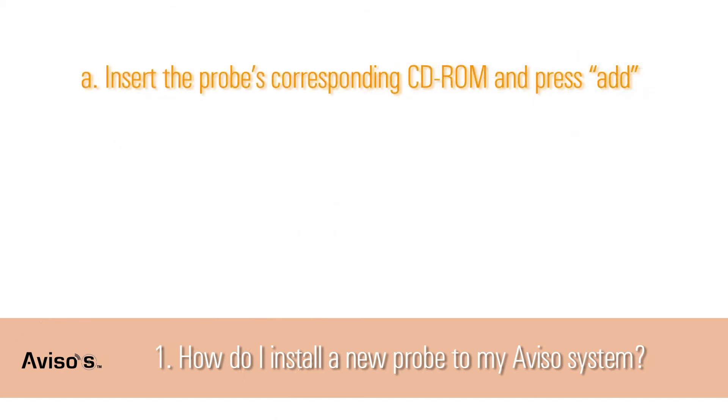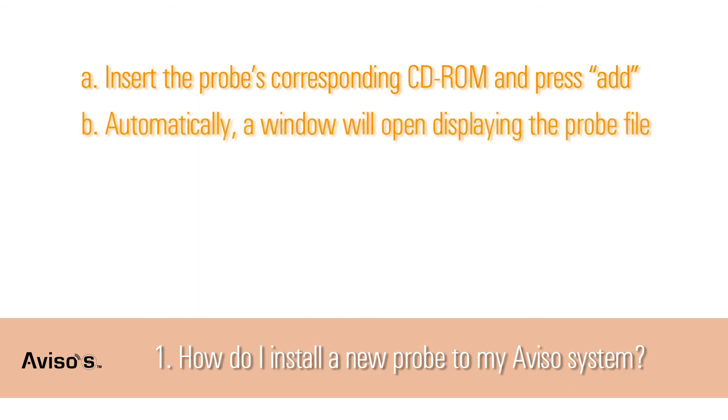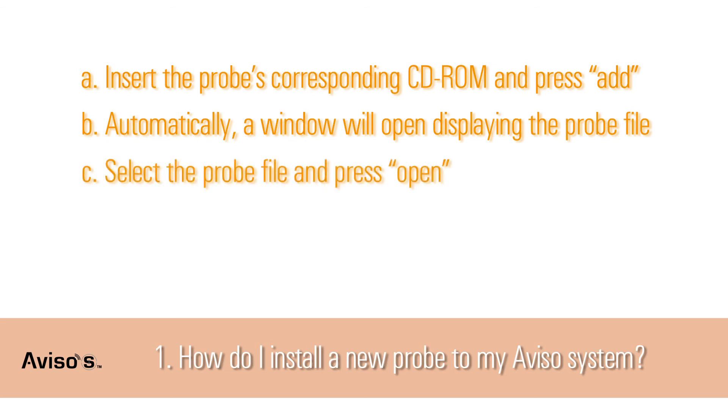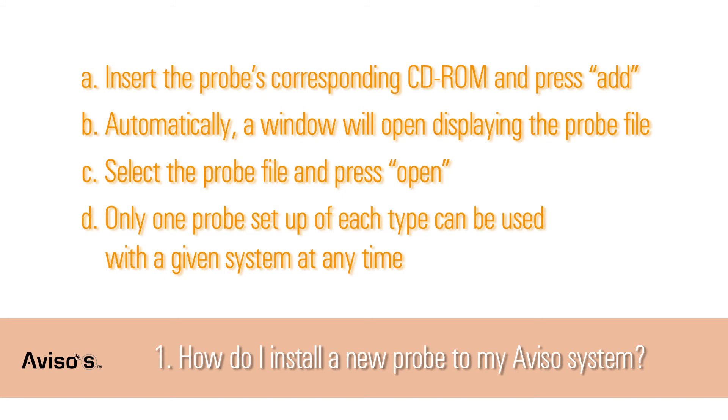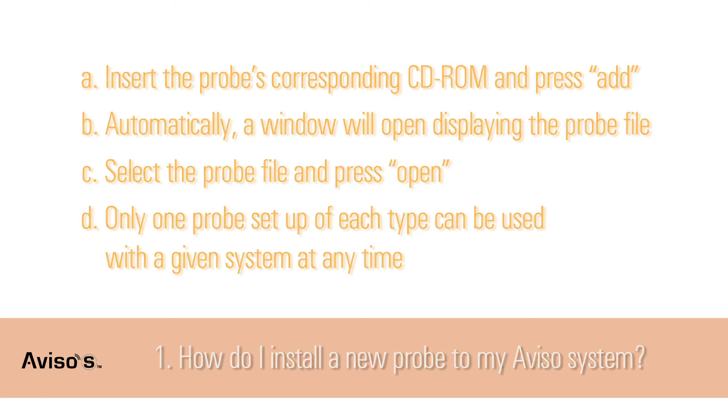Automatically, a window will open displaying the probe file. Select the probe file and press Open. The probe will then be added to the installed probe list. Note, only one probe setup of each type can be used with a given system. If an A probe is added in the field, it must be calibrated for use with contact technique. Once added, select the probe from the list and check its calibration on the test block. Procedure and specifications can be found in the user manual. If a probe of the same type is already installed, you'll need to suppress it. That is, you can visualize only one A probe, one B10 probe, one B20 probe, etc.